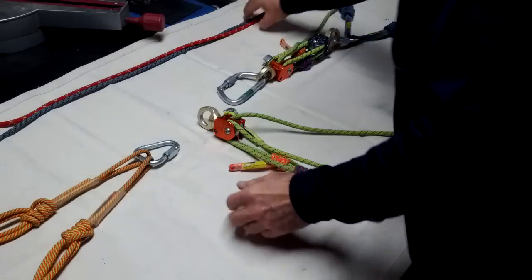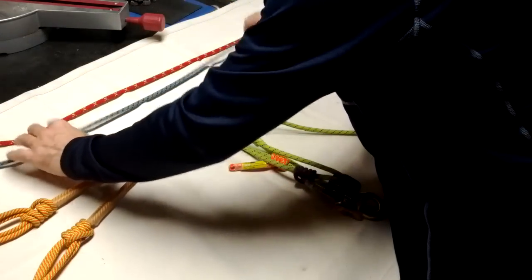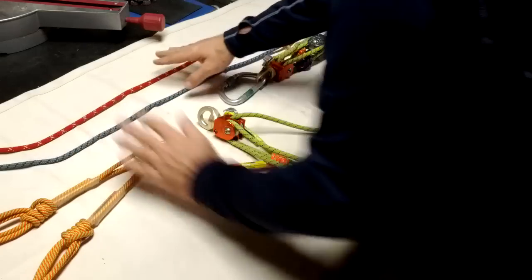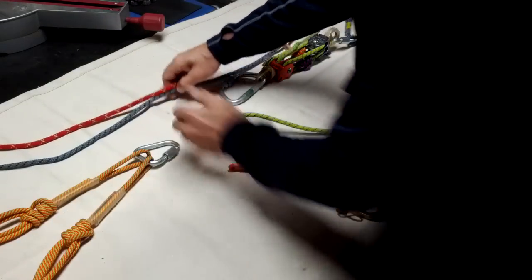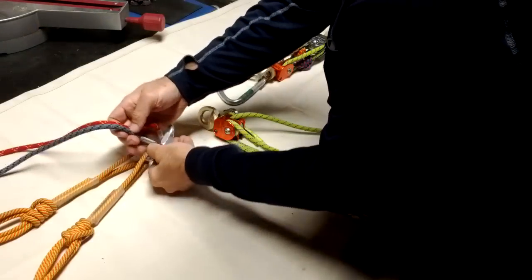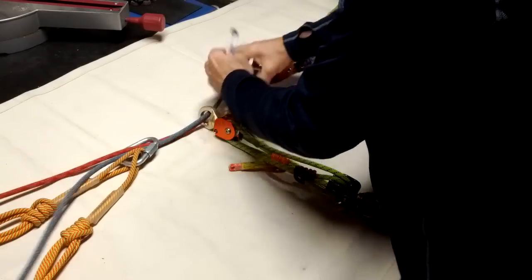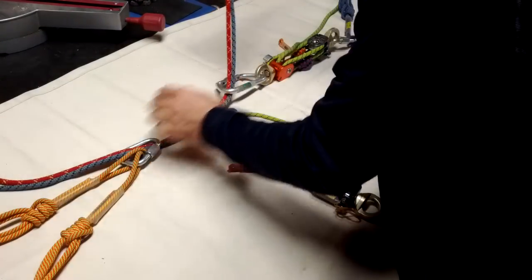Now we have a belay line and a main line. These normally would be 7/16ths or half-inch line. Thread it through the head connection, your personal Aztec, and the foot end of the stretcher.